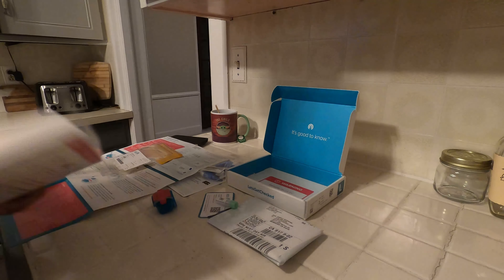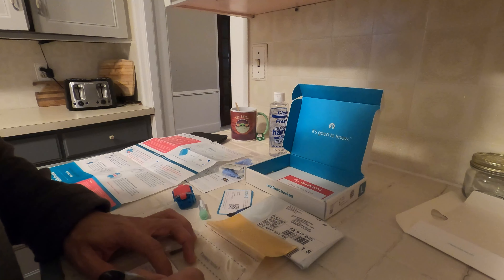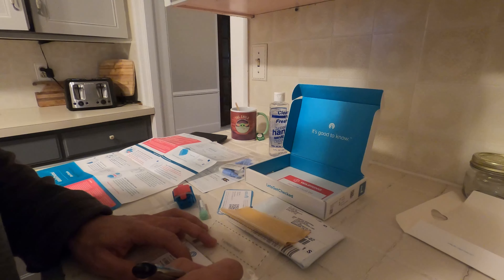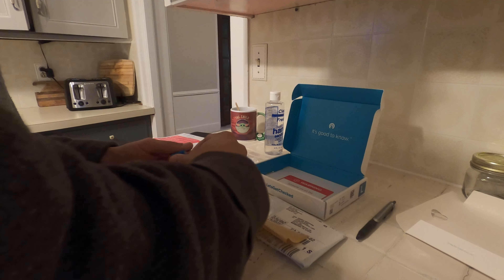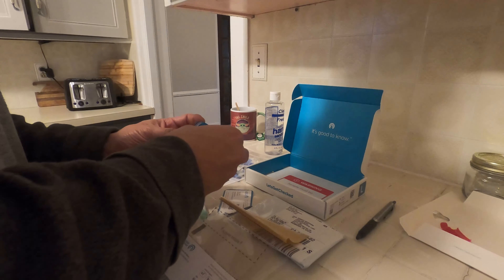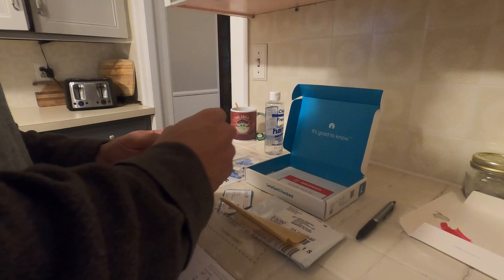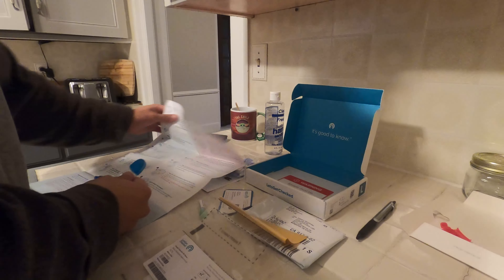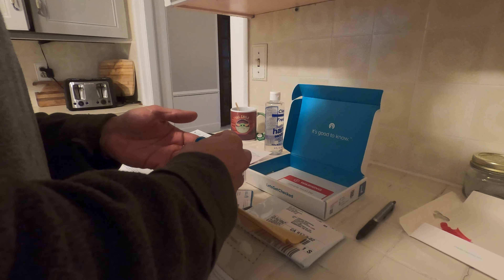Taking the test is fairly simple. One thing I failed to do was have everything ready — I rushed through the process, which I would not recommend. I recommend reading the instructions all the way through first, getting everything ready, and then executing the test. I didn't have the gauze laid out, which truly did slow me down and caused me to take four tries with the lancet. I'm now putting the phlebotomy device on my third finger, which is the finger they recommend for taking your blood sample.